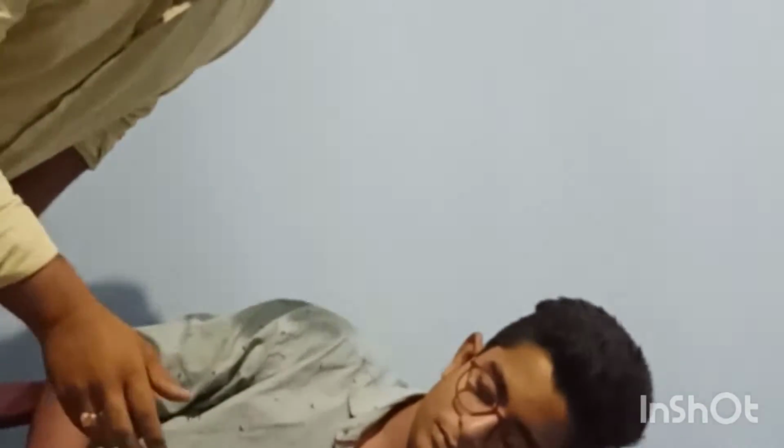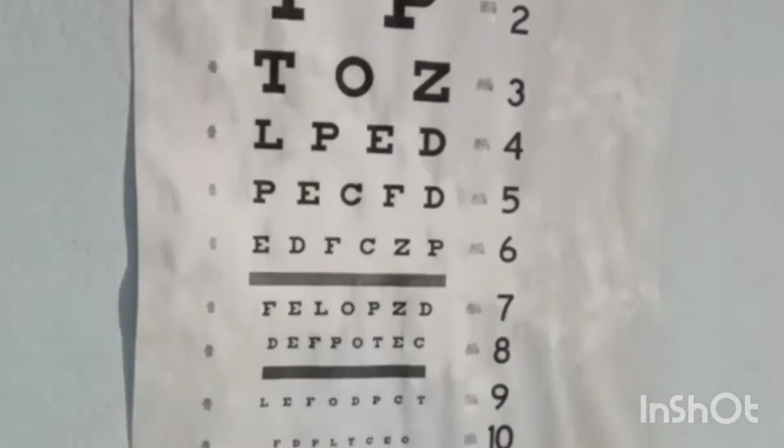Note the intervening distance. Visual acuity is expressed as two numbers. Example: 20 by 50. The first indicates the distance of the patient from the chart, and the second, the distance at which a normal eye can read the line of letters.